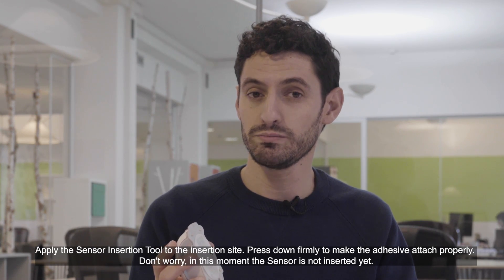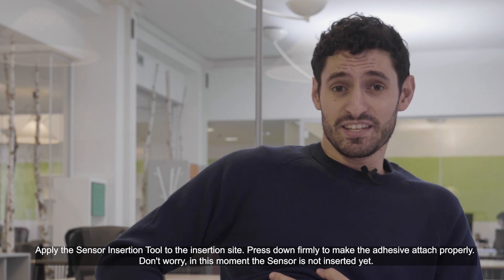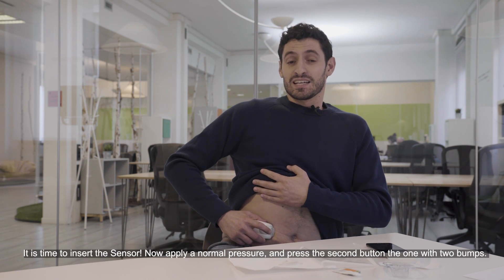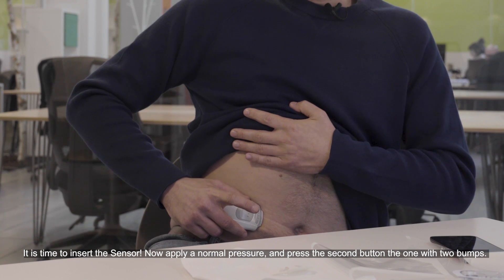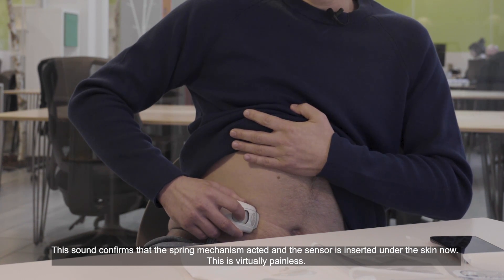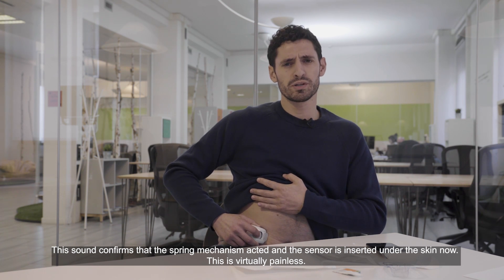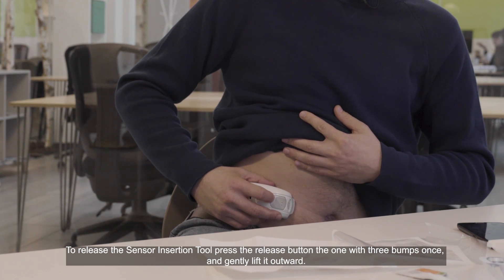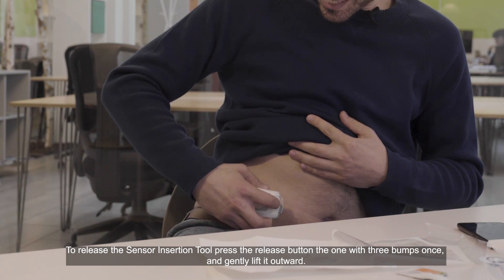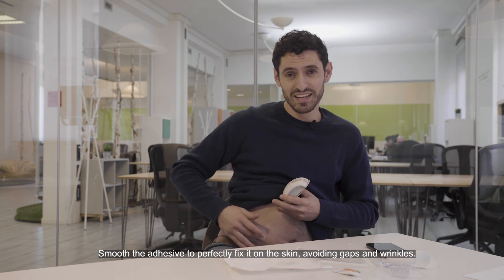Apply the sensor insertion tool to the insertion site and press down firmly to make the adhesive attach properly. Don't worry — at this moment the sensor is not yet inserted. Now apply normal pressure and press the second button, the one with two bumps. The sound confirms that the spring mechanism has acted and the sensor is inserted under the skin — this is literally painless. To release the sensor insertion tool, press the release button, the one with three bumps, once and gently lift it outward. Smooth the adhesive to perfectly fit it on the skin, avoiding gaps and wrinkles.